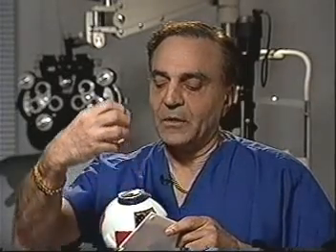The second way it differs is that I use now what is known as the flying spot LASIK. Now, flying spot refers to a whole new generation of laser technology. In the past, the laser that we introduced 10 years ago, we applied a single column of light onto the cornea. And that sometimes left some little ridges, which wasn't desirable. With the flying spot laser, we use a very tiny beam of light that literally flies over the cornea of the eye, reshaping it, and the end result is a very smooth surface, which is very desirable for good vision, good return of vision, and for no pain, basically.